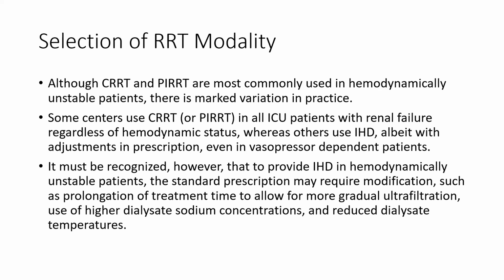It must be recognized, however, that to provide intermittent hemodialysis in a hemodynamically unstable patient, the standard prescription may require modification, such as prolongation of treatment time to allow for more gradual ultrafiltration, use of higher dialysate sodium concentration, and reduced dialysate temperature.